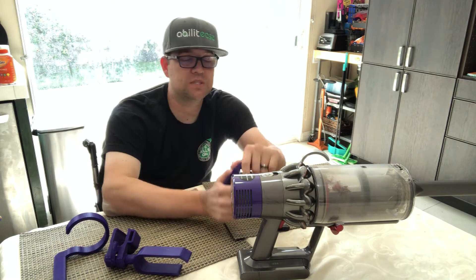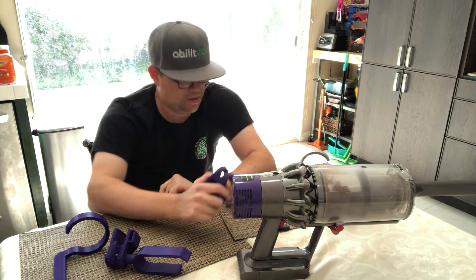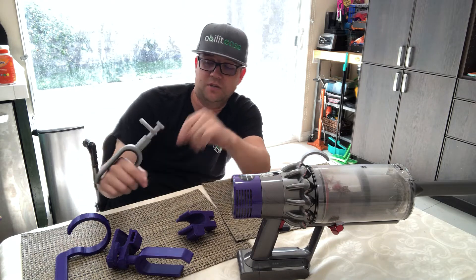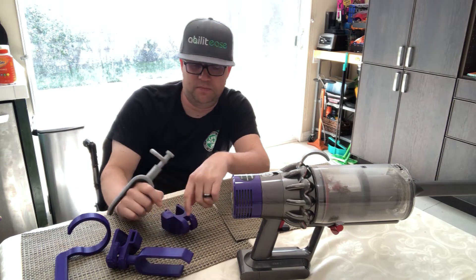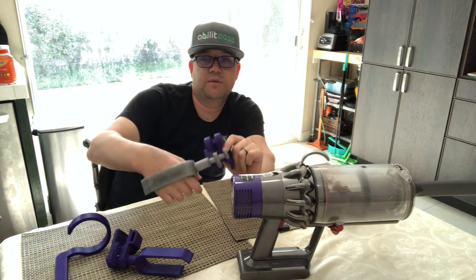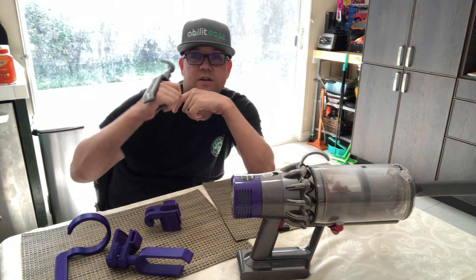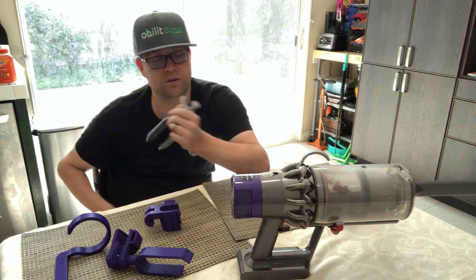That was the first thing — having something that would hold it. The next step was designing a cuff for wrist extension. This version is for a right-handed person. The idea is that it attaches to the handle, and when you do wrist extension, this little piece engages the trigger on the actual unit.